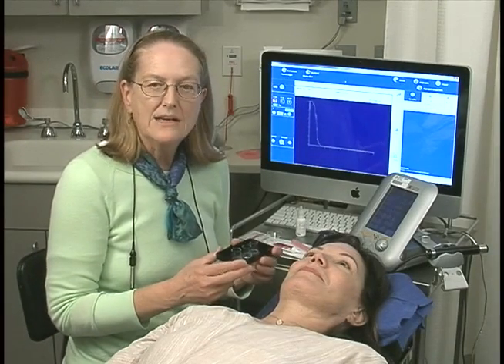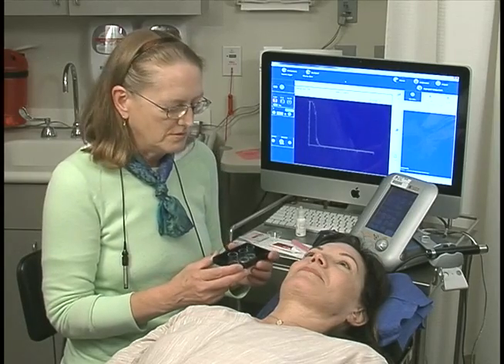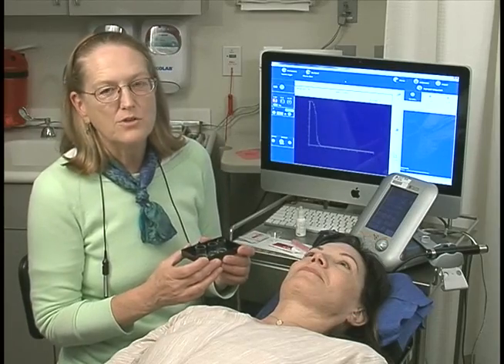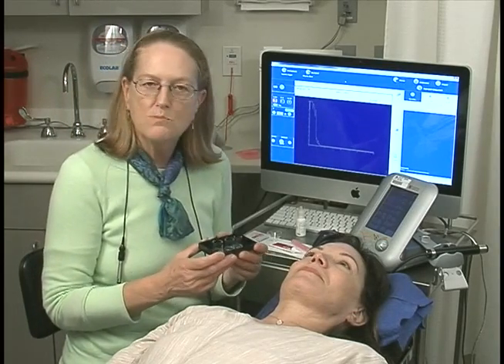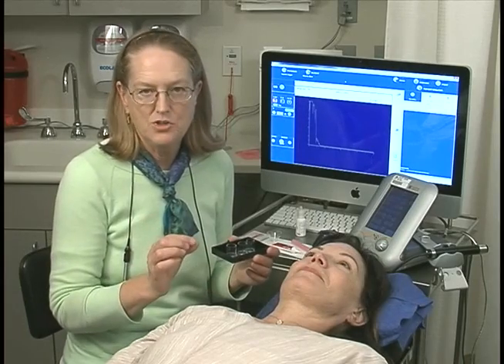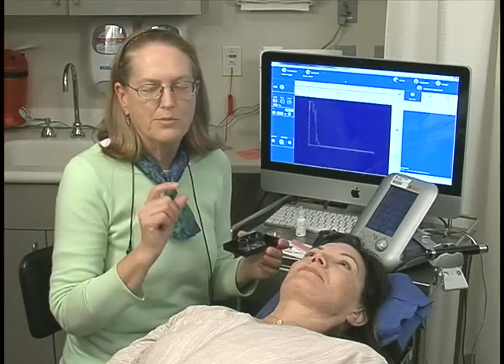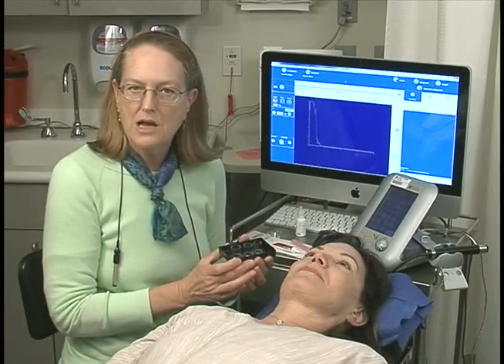Immersion biometry for axial length measurements is the standard of care all over the world. I'm happy to see it back, as it went away for a while with contact A-scan being used. We all know that immersion is the most accurate because nothing touches the cornea except fluid, and we really want pure, precise, and accurate axial length measurements. So we use a scleral shell.